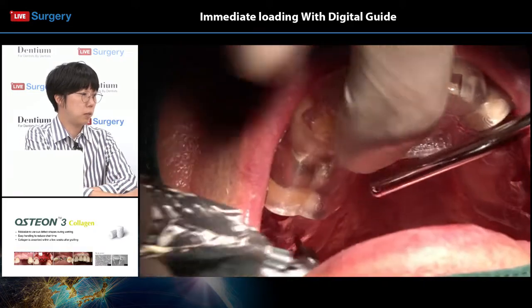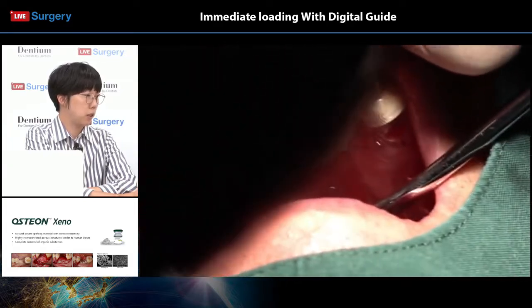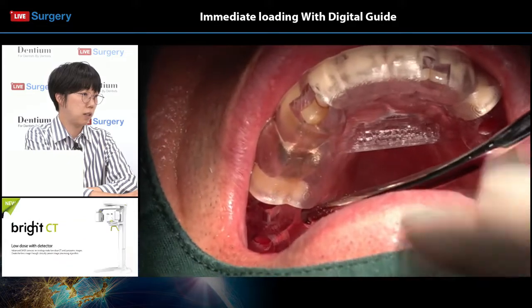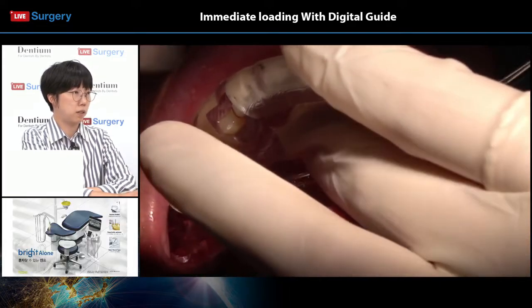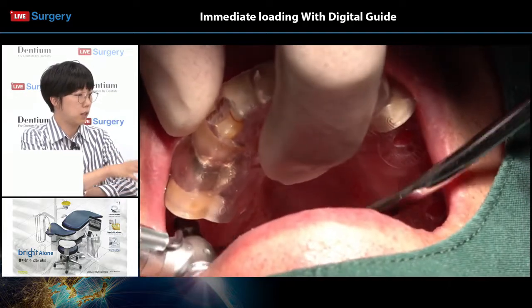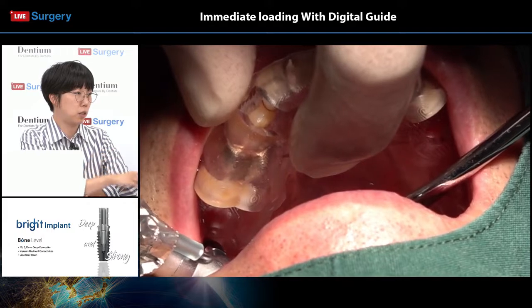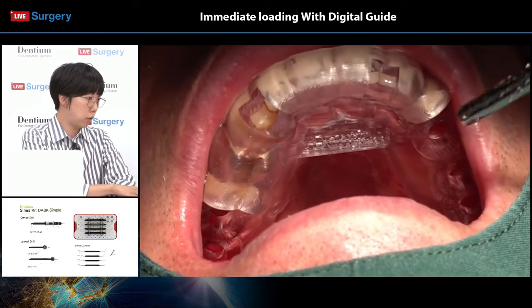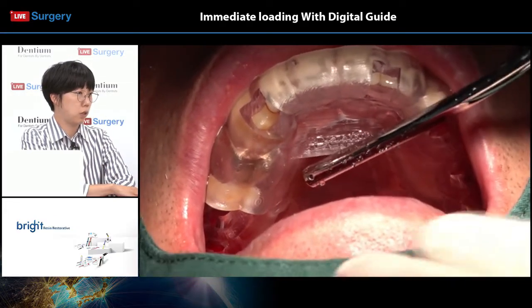The digital guide was made with a non-metal sleeve in this case as well. Dr. Lee prefers a non-sleeve design because when using metal sleeves, the sleeve itself is so rigid that the implant drills tend to get stuck in an unfavorable position. Okay, so Dr. Lee is punching out the soft tissue in a flapless surgery method.